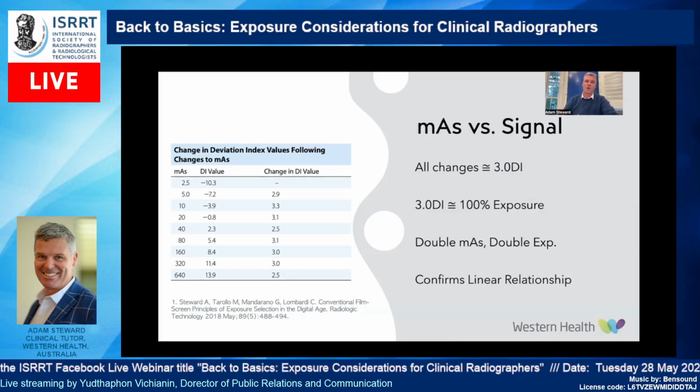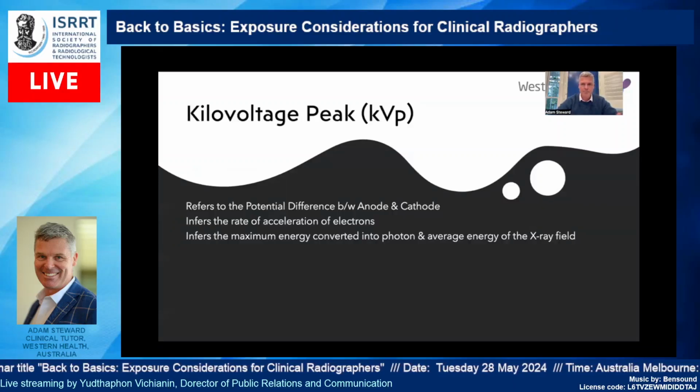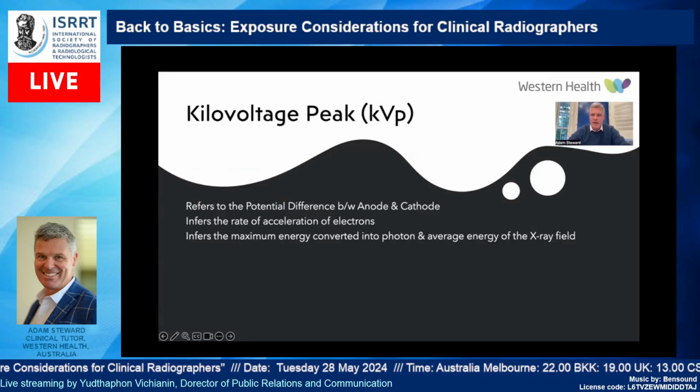So it's important to be aware of what that is in your system and making sure you fit within the realms of it. With the KVP, we understand what KVP is. That's going to control the average energy of your system, of your image, sorry, and it infers the energy itself, the intensity.